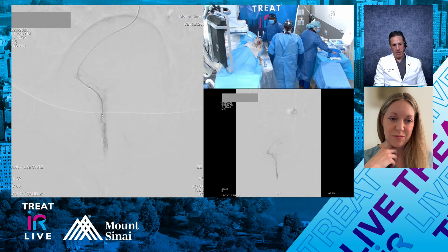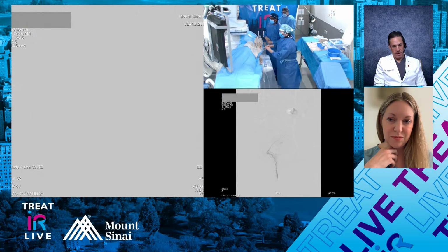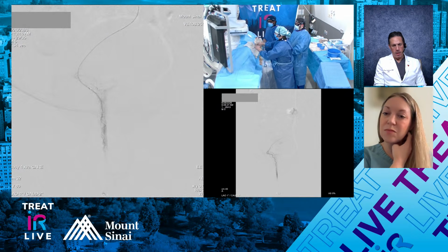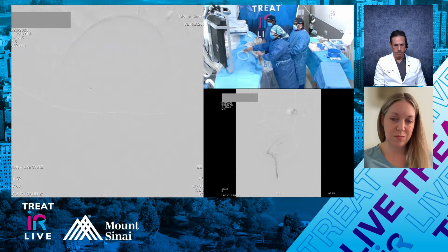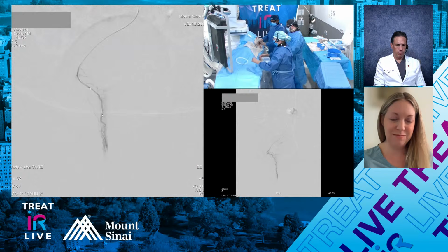Deploy here. Do you think that vessel's going to handle a 3? Looking at the size of the vessel, I wonder about the 3. I know the soft coils probably don't matter too much because they're going to coil pretty easily. Even if it gets pushed back a little bit, I don't know that that's any type of disaster in this location. I think that would be totally fine.